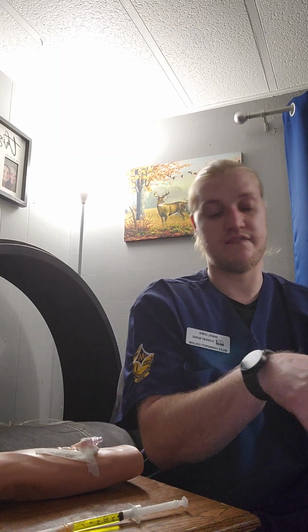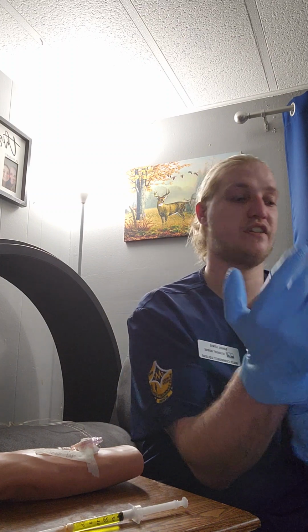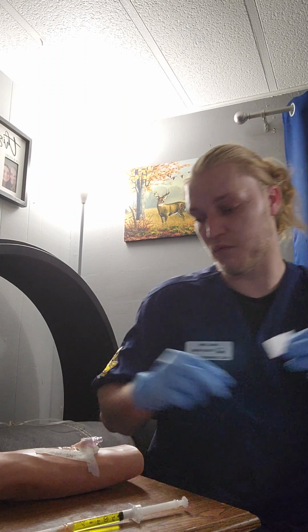So what I'm going to do is go into the patient's room. I would wash my hands or do hand hygiene. I'm going to apply clean gloves because I've already verified the patient, and I've done the 3 checks for the medication, making sure it is the correct medication to be giving. The first thing I need to do is clean and flush the saline lock to make sure that it's still patent. So I'm going to open up an alcohol wipe and clean the saline lock port.